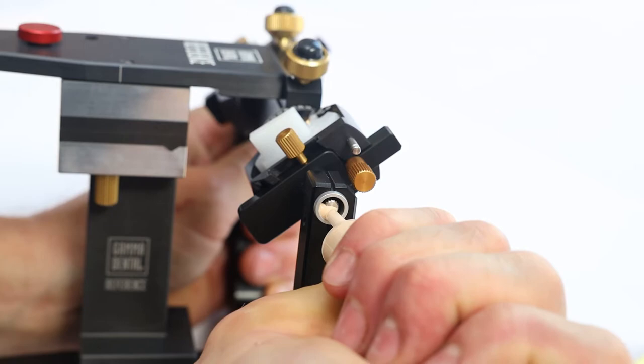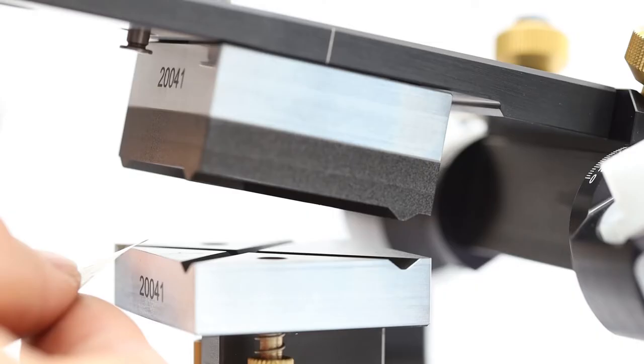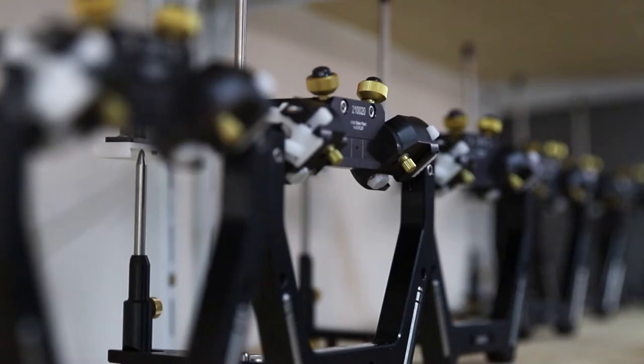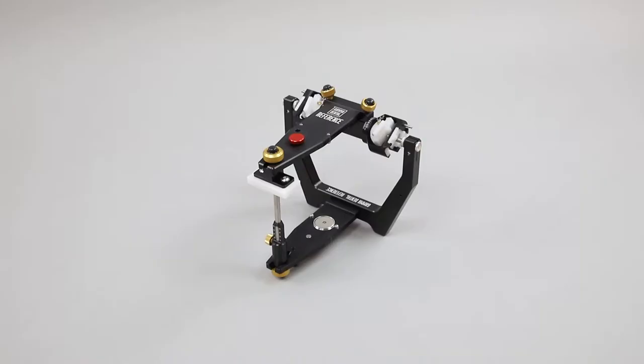An articulator, in general, is a device used in dentistry to which plaster casts of the maxillary and mandibular jaw are fixed, reproducing some or all the movements of the mandible in relation to the maxilla.